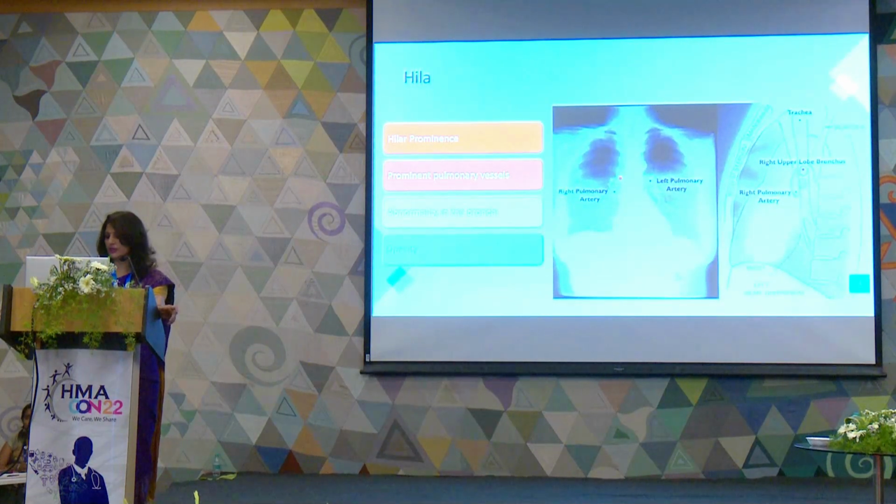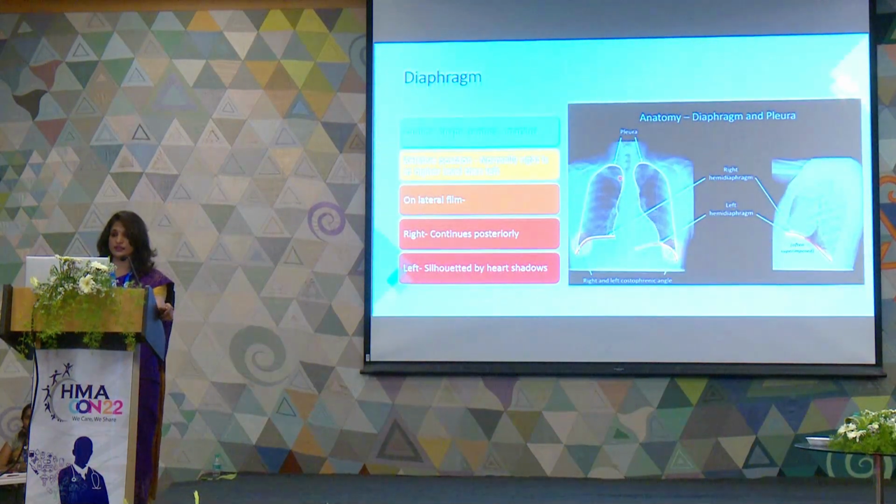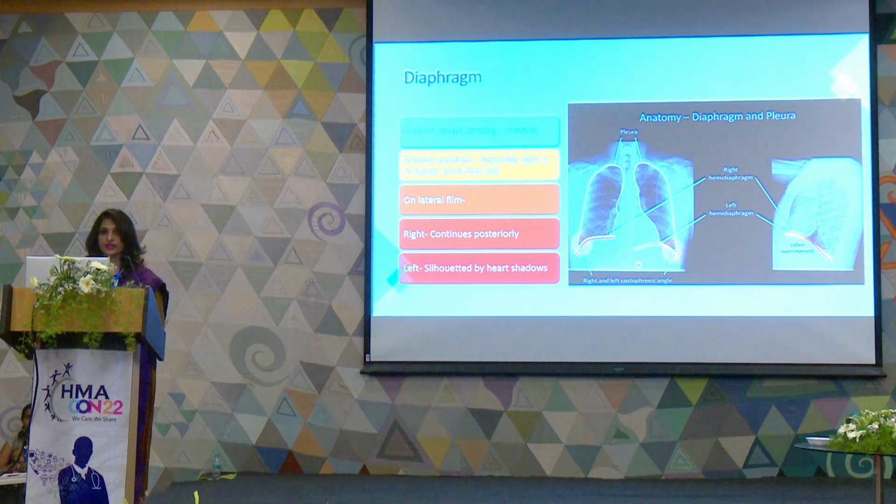Look for the hilar prominence, any mass in the hilar region, etc. Also, see the diaphragms. Look for the outline, shape, and tenting margins of the diaphragm. This is right, this is left. Generally, the right is higher than the left hemidiaphragm.